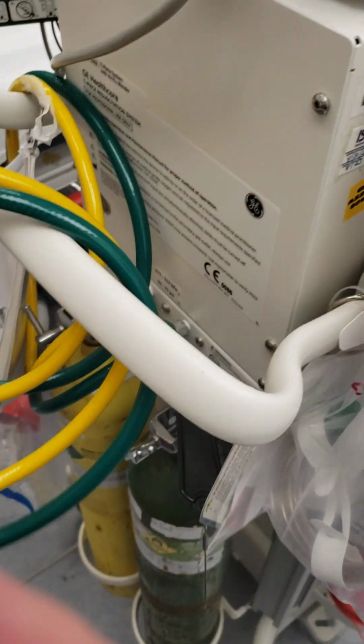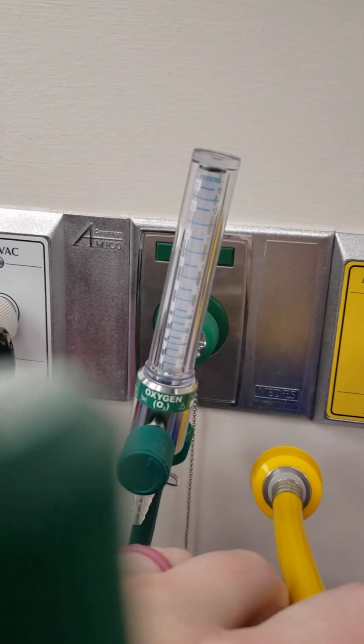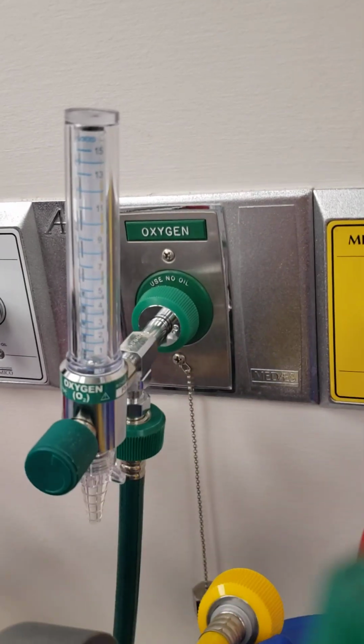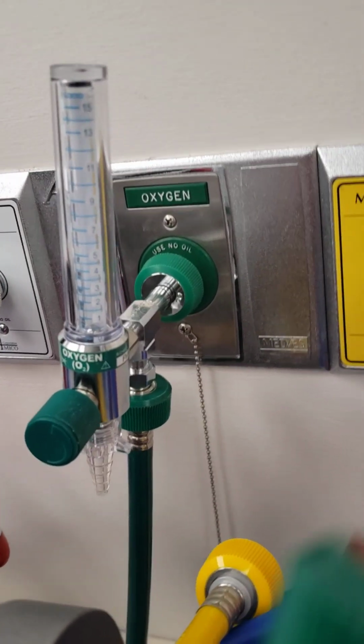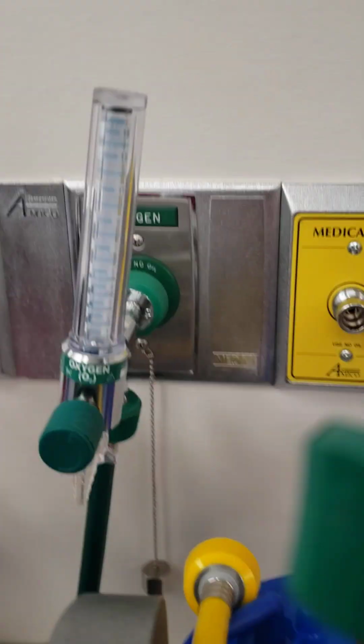Now, we do need these to hook up to the wall. Hang on while I get them untangled. And we can find those hookups over here. So the yellow is going to hook up to the yellow. The green is going to hook up to the green. You may have to take one of the oxygen trees off of the wall in order to plug this in, but it can be done.